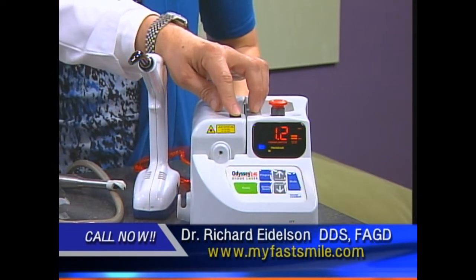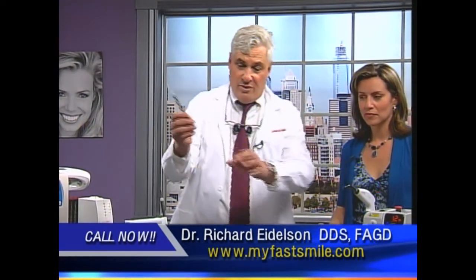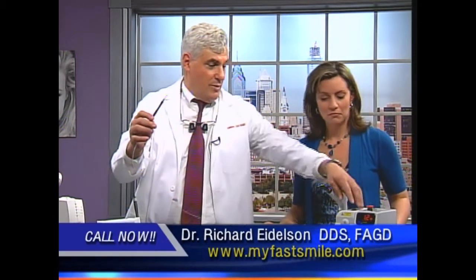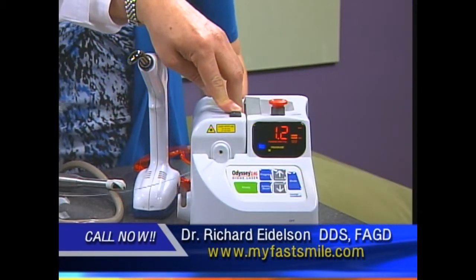What we do is we set up the laser, and the laser energy goes through this cord, I guess. Cord. Right? Well, it's fiber optics. So I'm going to put this back because we don't want to turn the laser on now. No, please keep us safe.